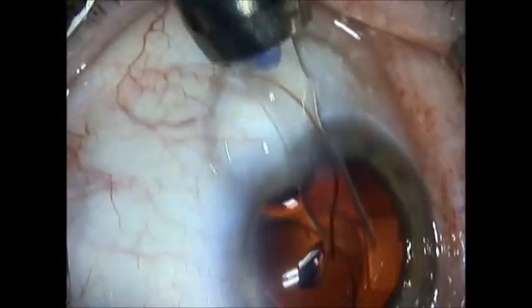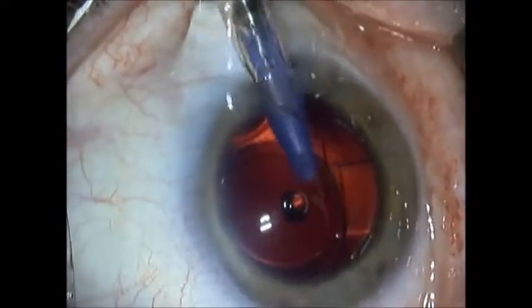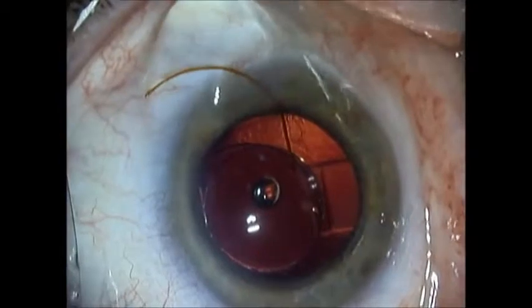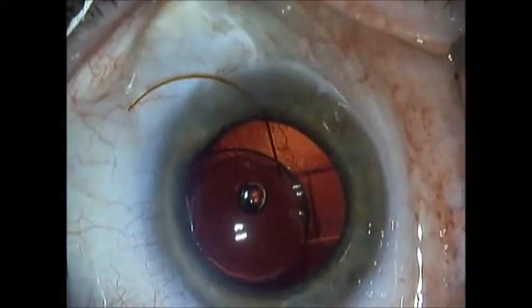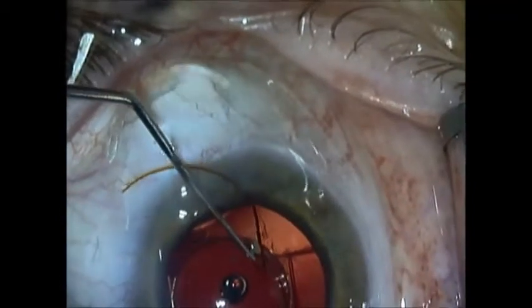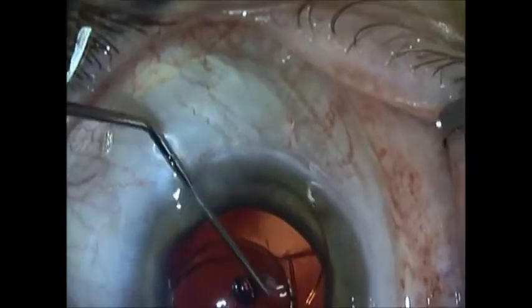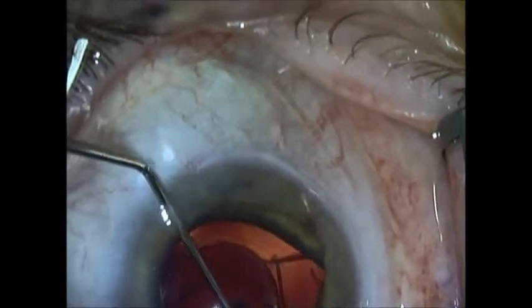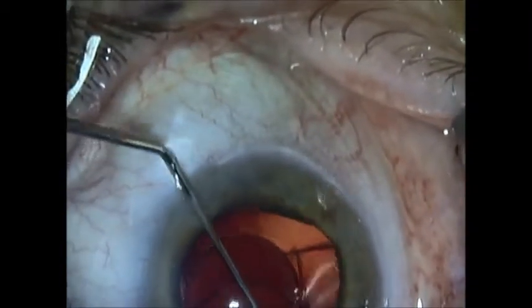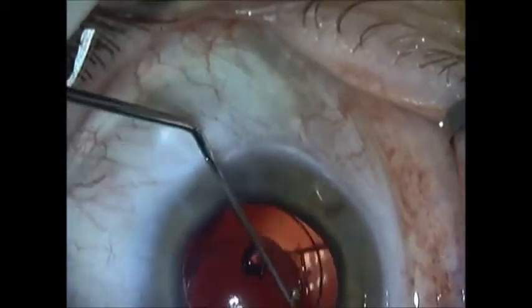I am delivering the AQ5010 piggyback through an AMO Silver Series Inserter. I find that this is the easiest way for me to deliver this implant with very large haptics. I am dialing the AQ5010 in and trying to separate the haptics so they are 90 degrees apart. I find that gives the best stability in the eye.